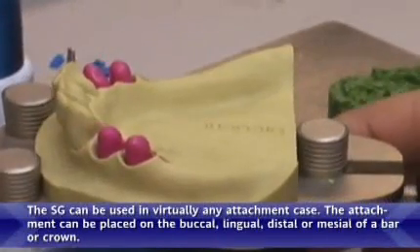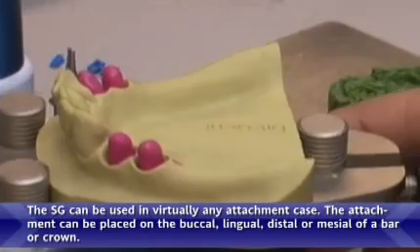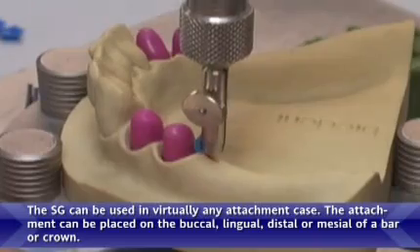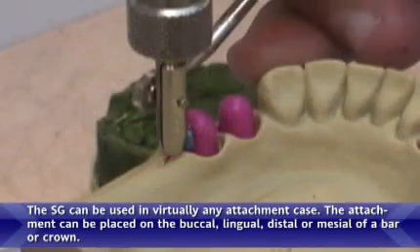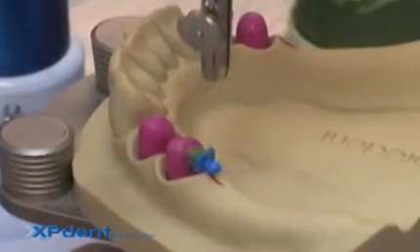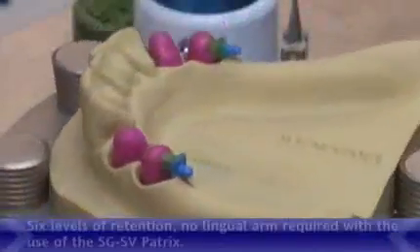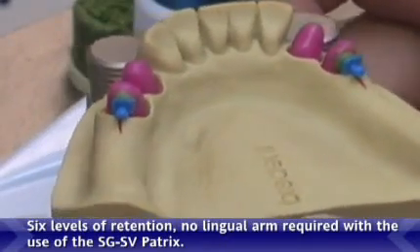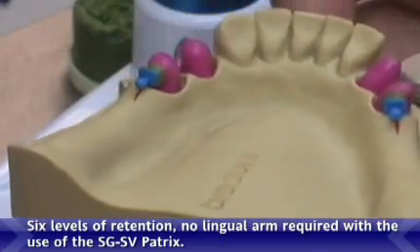The SG can be used in virtually any attachment case. The attachment can be placed on buccal, lingual, distal, or mesial of bar or crown. Six levels of retention. No lingual arm required with the use of the SG-SV Patrix.